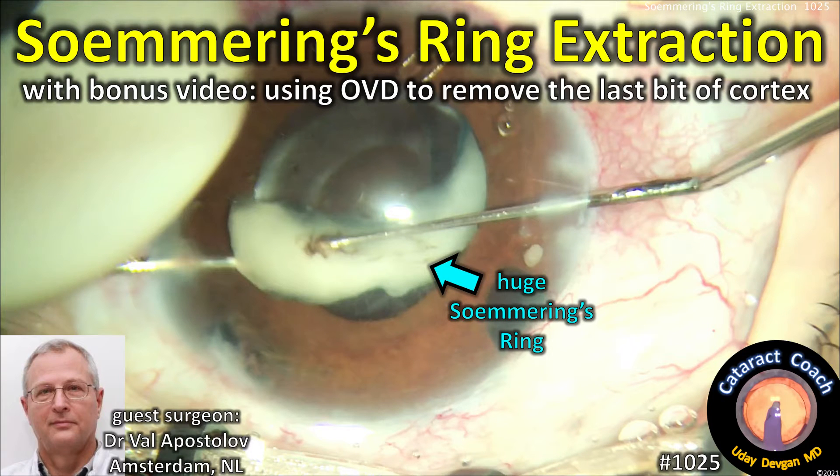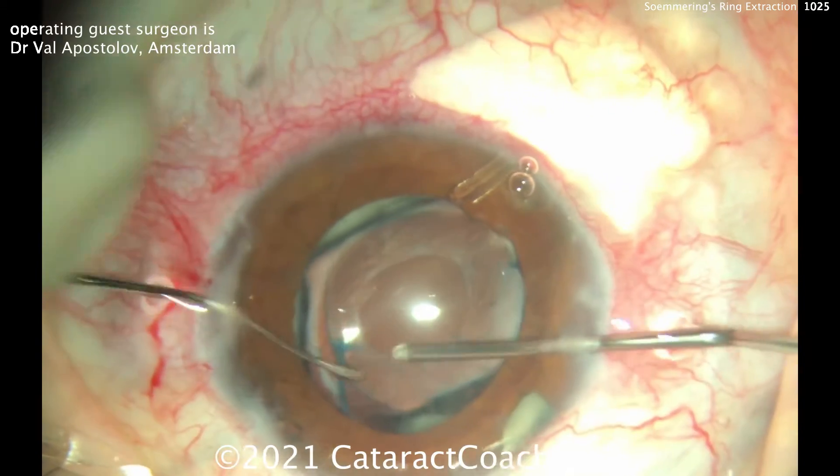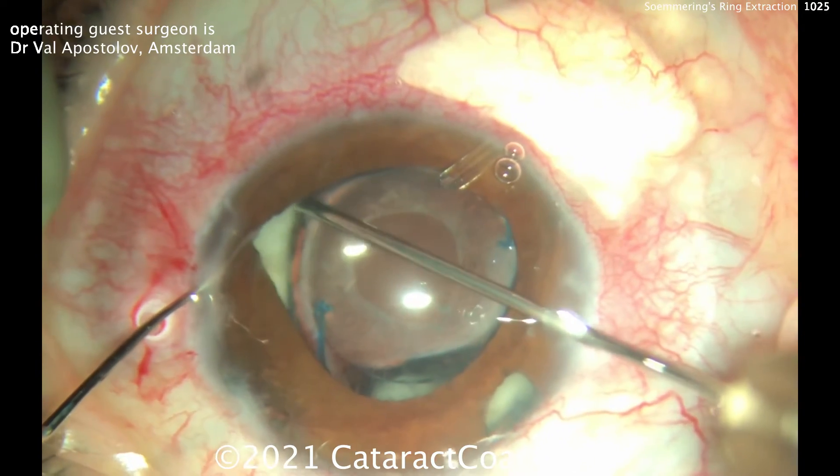CataractCoach.com presents a Soemmering's Ring extraction and a bonus video on how to use viscoelastic to remove the last bit of cortex. Our guest surgeon is Dr. Val Apostolov from Amsterdam. There are a lot of videos from Val on the website — he's really enjoyable to watch.